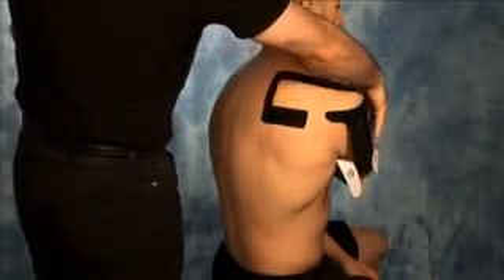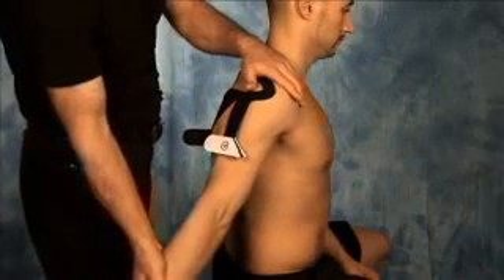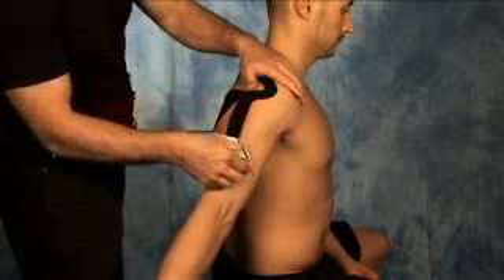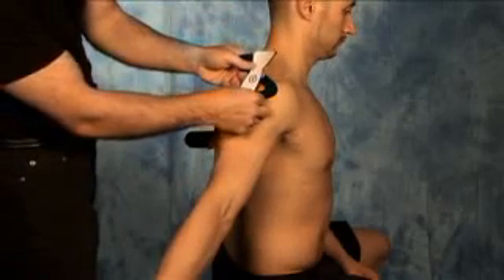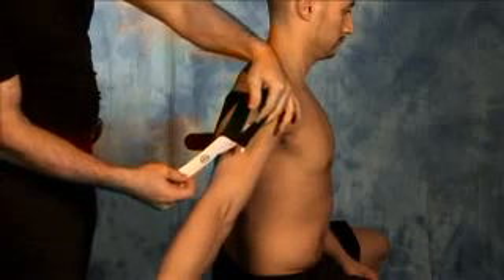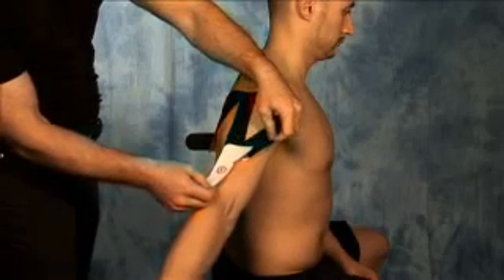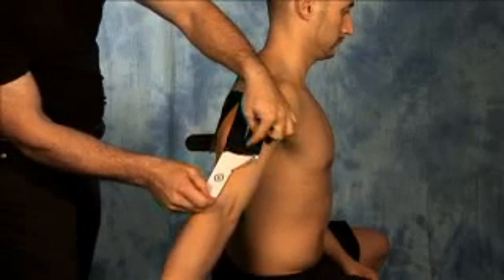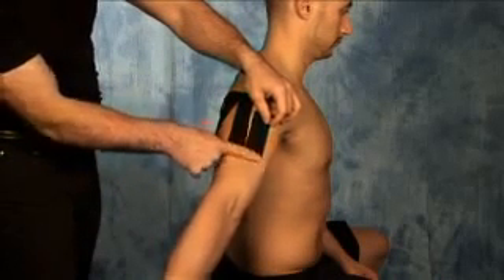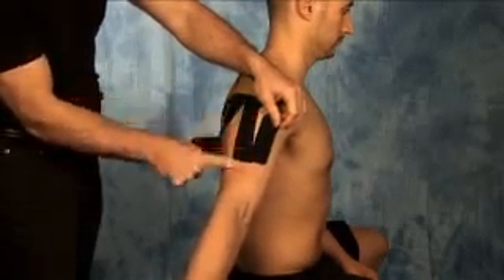For section number five, take the arm, straighten it out, and extend it back behind the body, stretching out the anterior delt and the bicep. Start peeling back the backing of section number five, allowing the tape to come in gentle contact with the lateral portion of the arm. Let the tape come in contact with the skin and gently rub over top of it, smoothing out any creases.